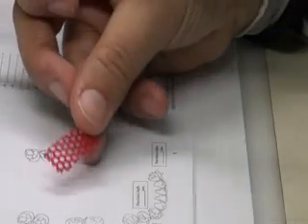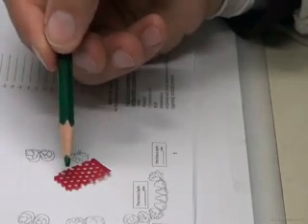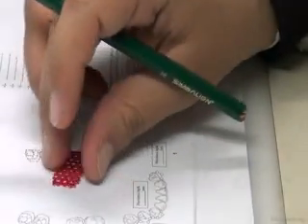Retention of what? Yes, acrylic retention. The way the acrylic comes in this mesh area, it contacts the lower layer and upper layer through the holes. These holes are small, so we don't get the best retention.